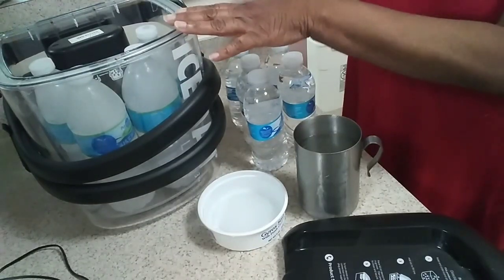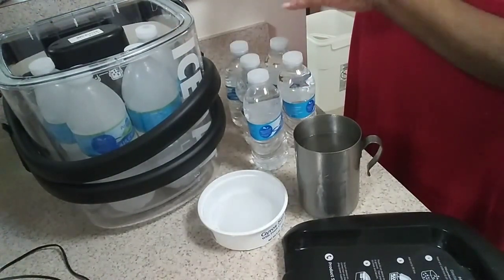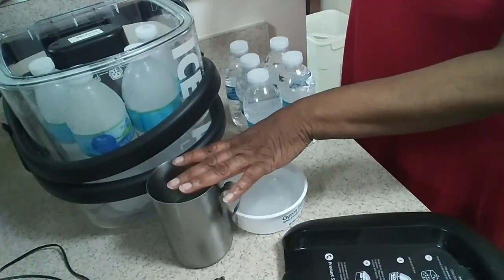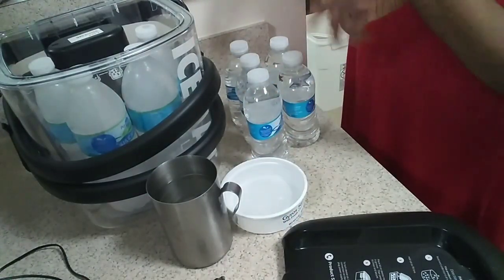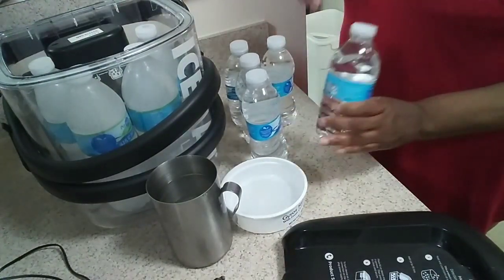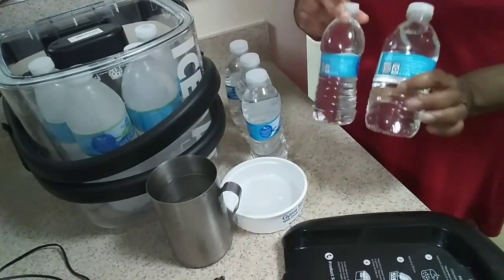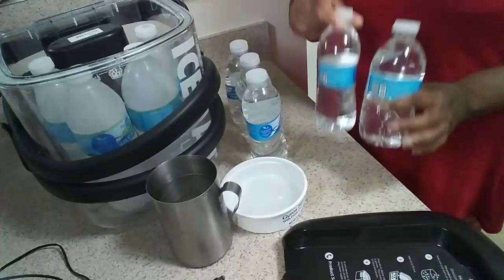I thought of an ice maker, but I wasn't able to get that. So I went online and searched just to see what others were saying about how they're able to keep ice in here without going bankrupt. That's when I discovered people were using frozen water bottles. They would take these bottles, throw them in the freezer, let them freeze up, and that would be the ice.